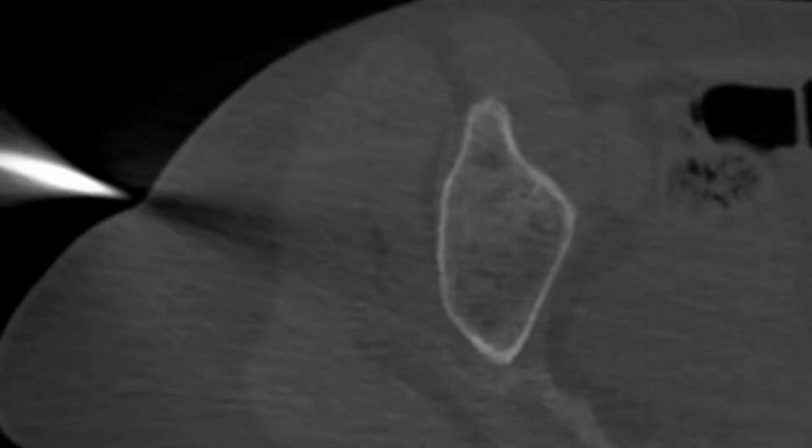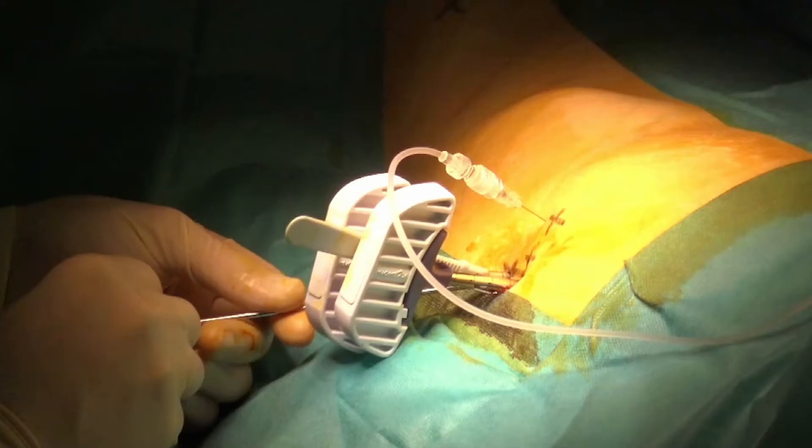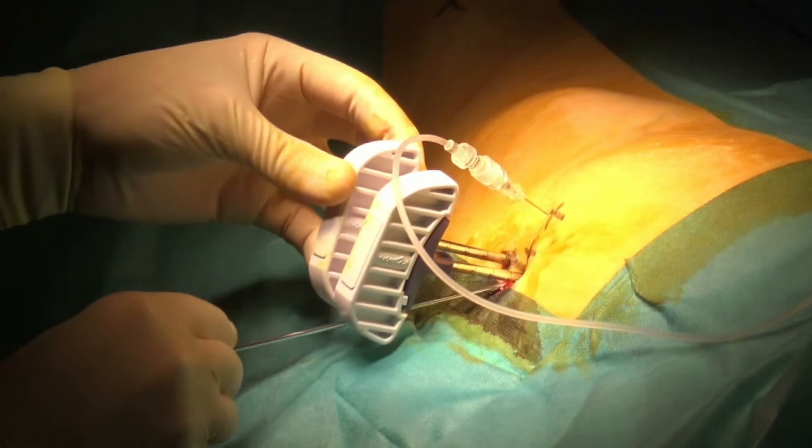A short 3D acquisition is performed to assess the proper location of both introducers. As seen on MPR reconstructions, they are located as planned at the superior and inferior part of the metastasis. Before proceeding to probe insertion, protection of the joint has to be considered, as thermal injury in that location can lead to devastating secondary joint destruction. To do so, a 13-gauge bone trocar is inserted in between the two Osteocool introducers.